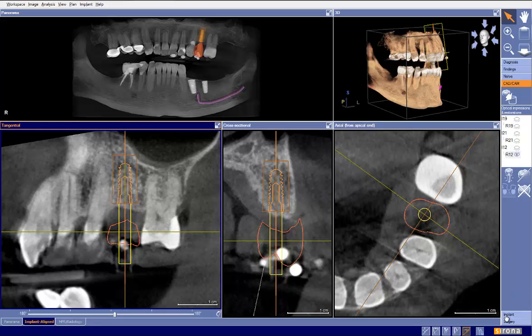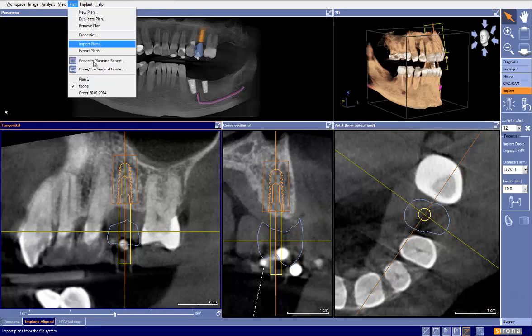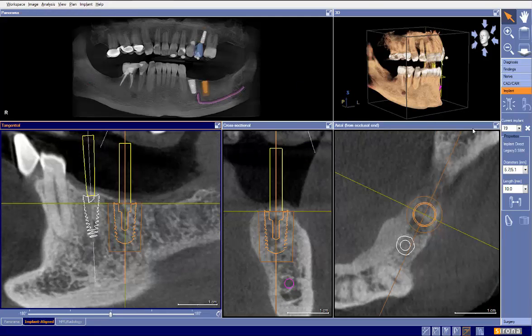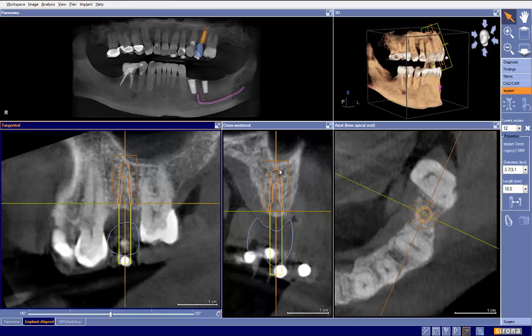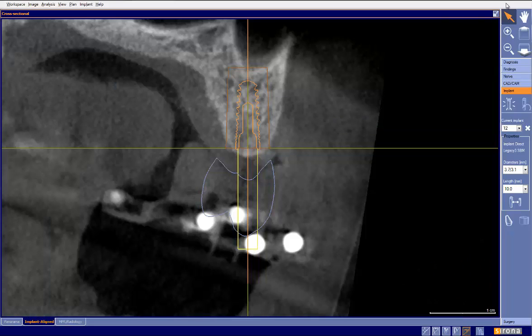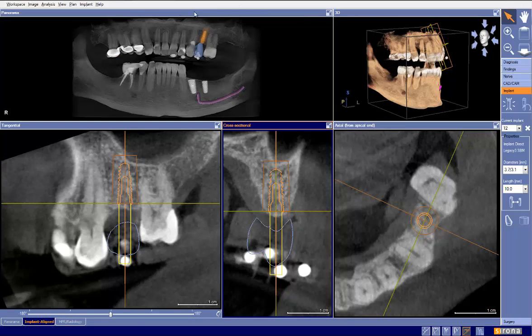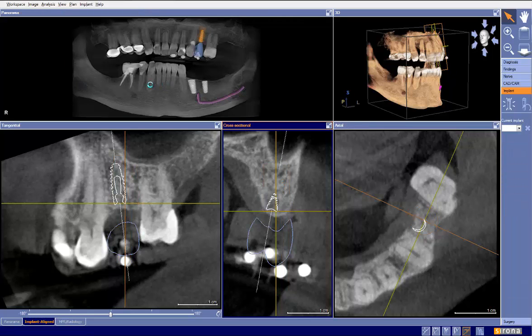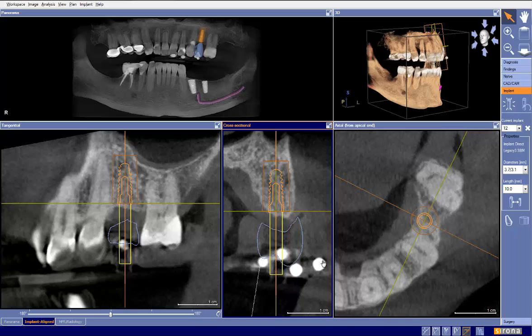So what I would like to do is show you this tooth from the original plan, plan 1. Let's take a look at tooth number 12, just like so. And as we can see here, as we're coming out of the buccal cusp, like so. And now let's take a look at this with our new plan for tooth number 12, and we can see here now we're coming out of the central groove. So now I know we have plenty of bone around the implant. It's going to be supported very well.